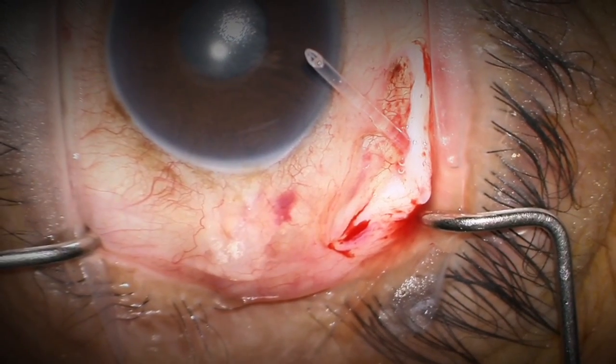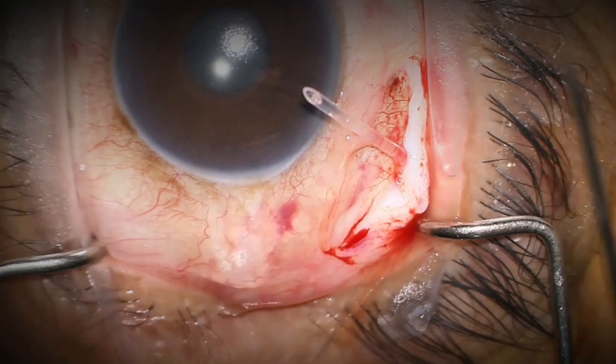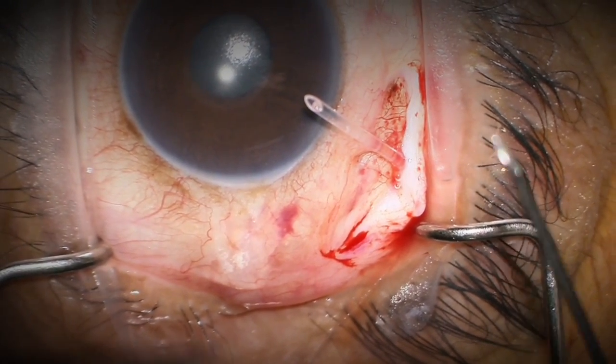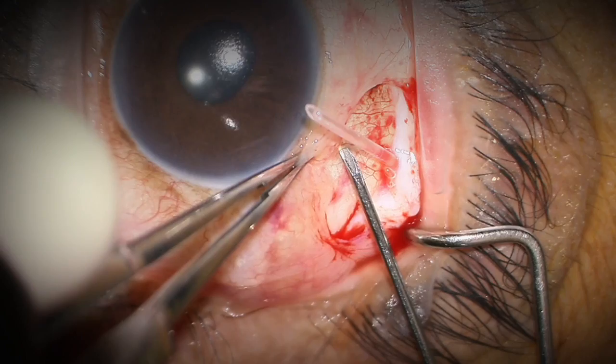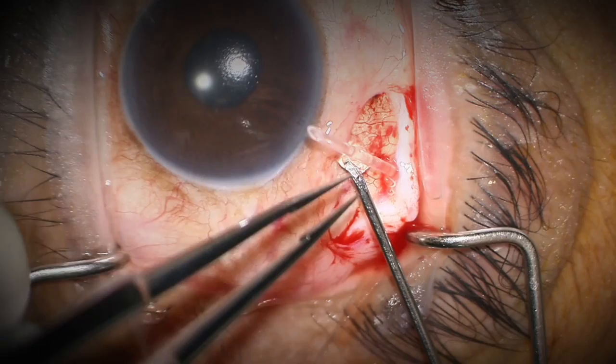I trim the tube and anticipate placing it into the anterior chamber in a somewhat tangential manner. I have a curved 23 gauge forcep with provisk or some cohesive viscoelastic loaded on it. I'm not going to make a corneal paracentesis because I think it's usually not necessary.